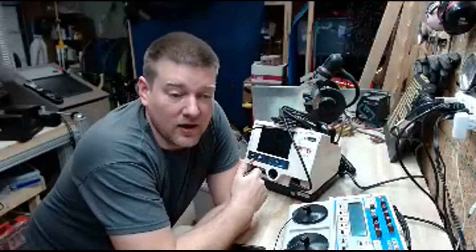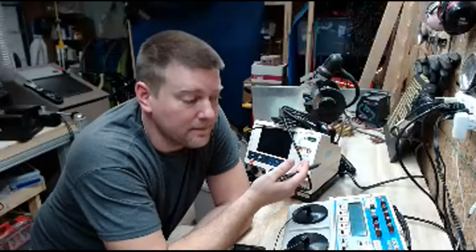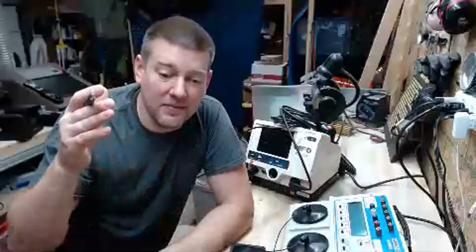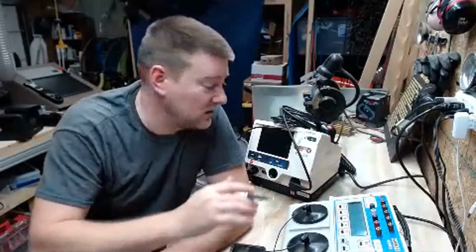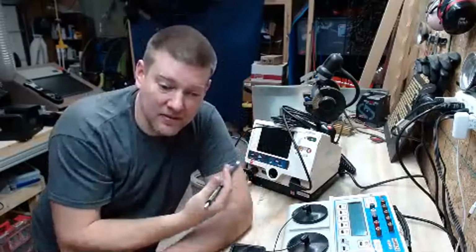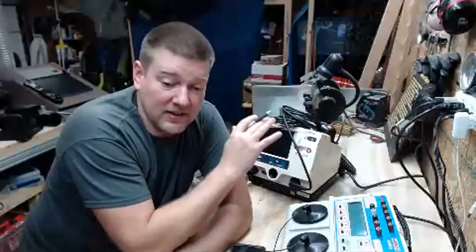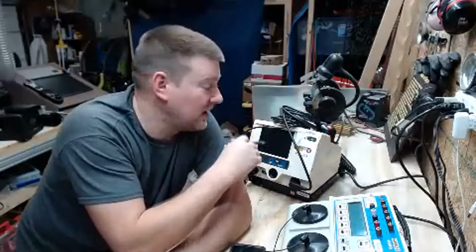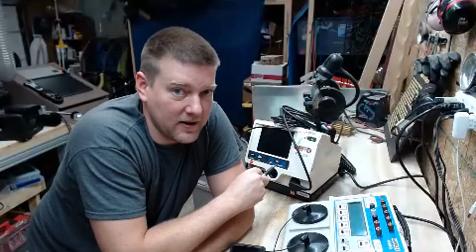With these defibs, you see how it shut off on me when I switched between modes? I'm going to try and duplicate that. I'm going to take this excerpt of video and go over it in slow motion. I pressed the button once, and I pulled back away from it, so it's not like I double pressed the button. And if anything, I'm going to take that video footage and send it to these guys at Physio Control, and see what they say about it.